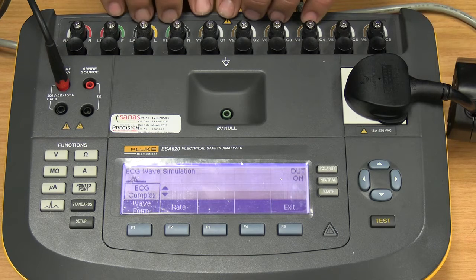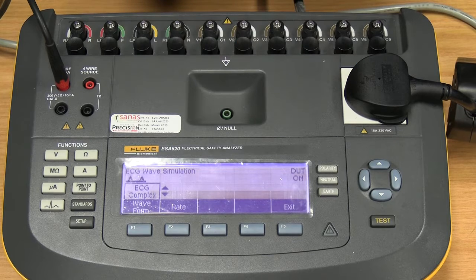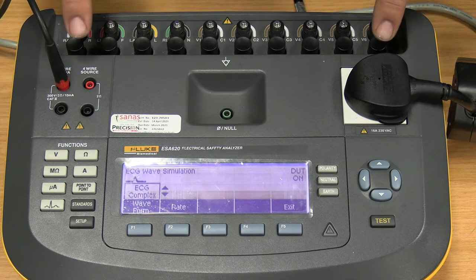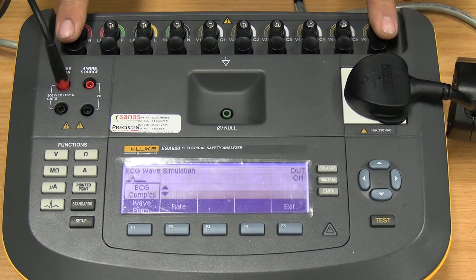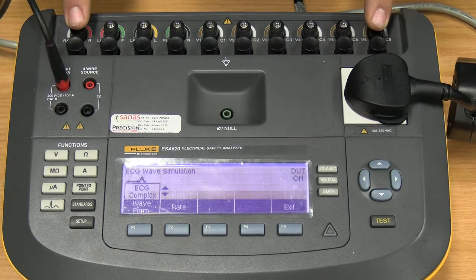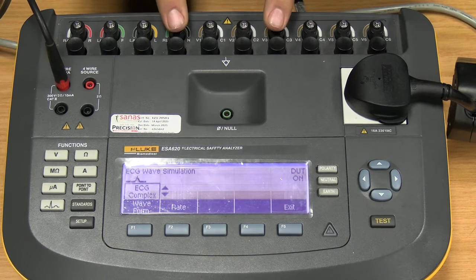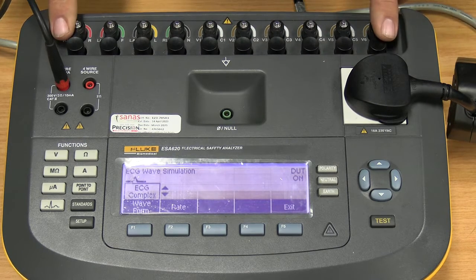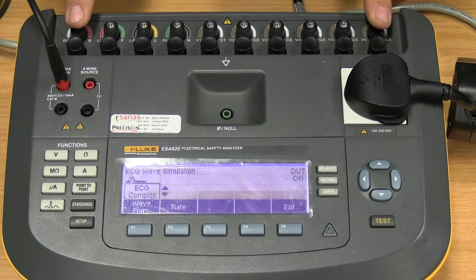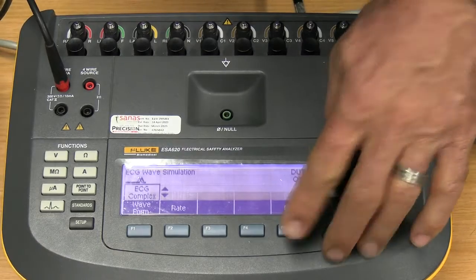What I'd like to point out, though, as well is, please remember this has big transformers inside, causing a lot of noise, unfortunately. So do not use this ECG simulator for diagnostic purposes. Only use it to supply a signal to say, okay, there's a signal, okay, it works. Do not use it to measure the signal width or height or any of those type of things. For that, you use a normal signal generator. There's your rate again for your complex and the exit button.